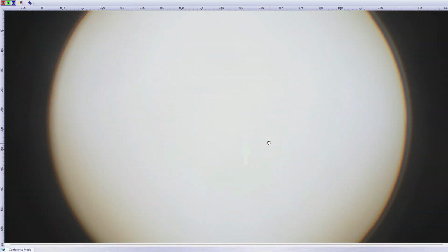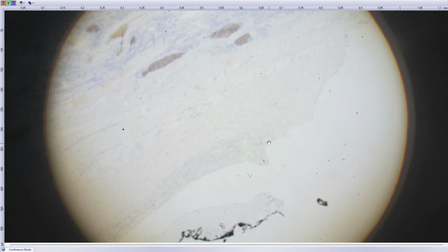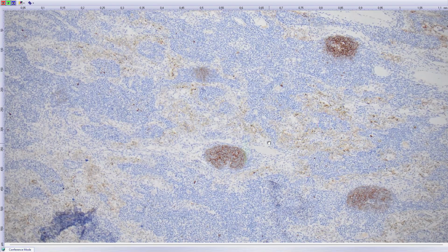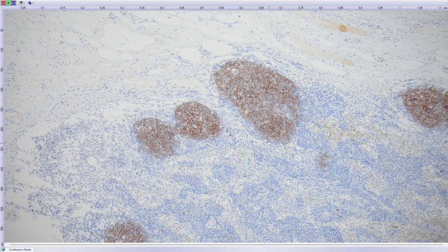So as Natalie said, great idea to do CD21, CD23, and CD35. Those are so-called follicular dendritic cell markers. They stain follicular dendritic cells and probably a bunch of other things, which I don't know. Here is the adjacent lymph node, which shows you the immuno is working well. This is CD21, but the tumor somewhere something stains, but it's not great.